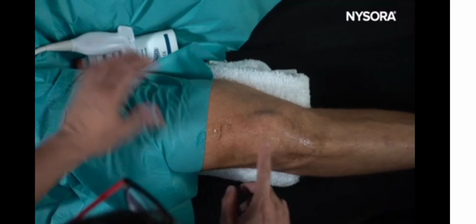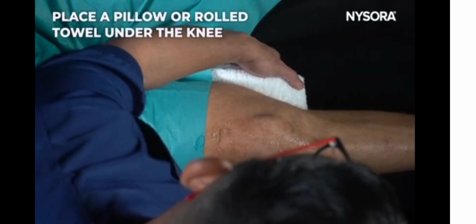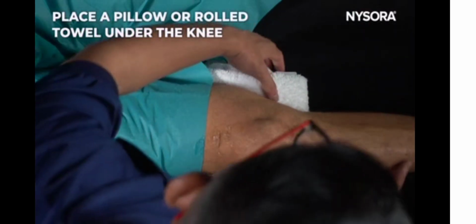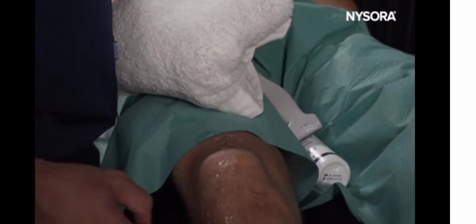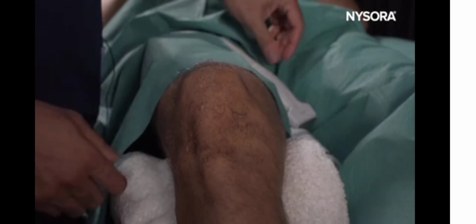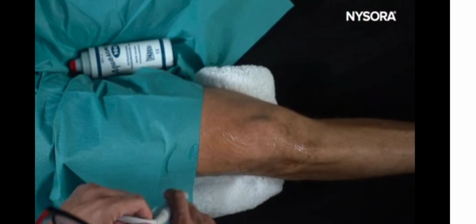To perform this injection, the steps would be to put a pillow or a rolled towel under the knee. This particular maneuver helps to pull the synovial fluid into this suprapatellar recess. If you make the patient extend the knee, unfortunately, this will push the fluid down and you will not be able to see any effusion or fluid in the suprapatellar recess. Hence, it's important to give about 30 to 40 degree flexion of the knee in order to see the fluid or the effusion in the joint capsule.